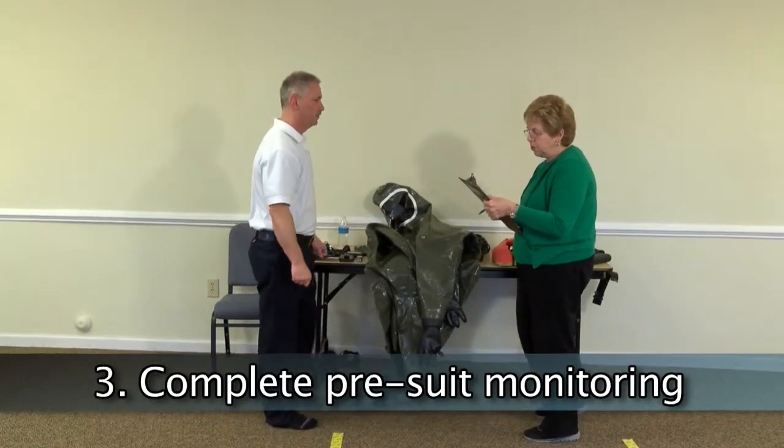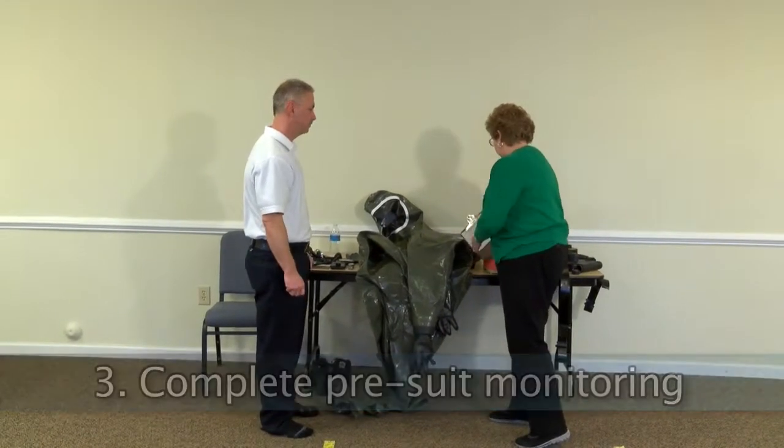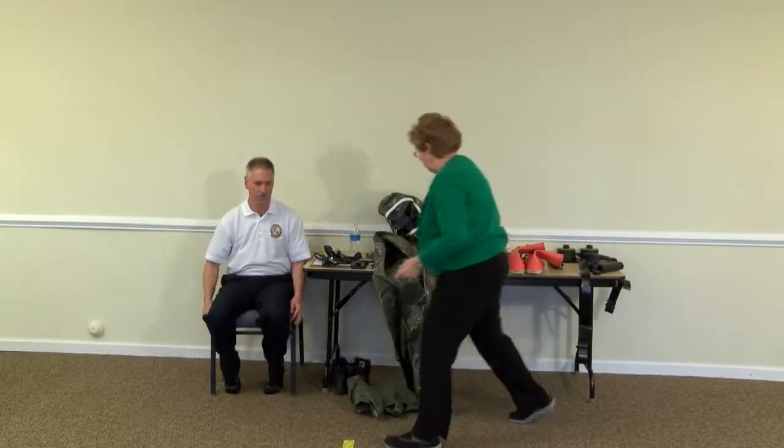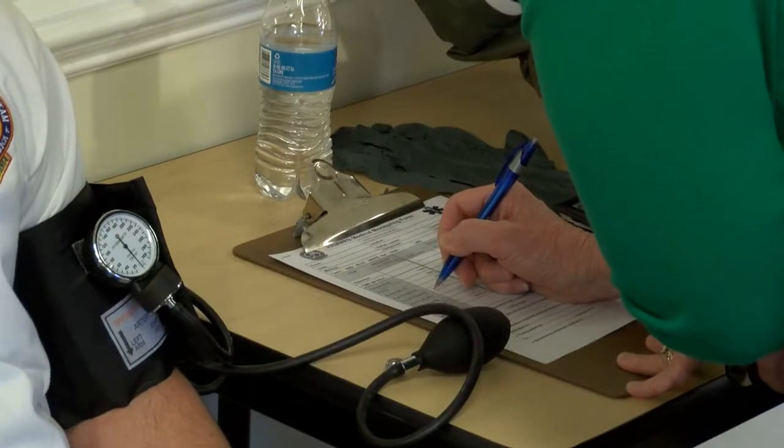Complete pre-suit monitoring by doing baseline vital signs. Prior to donning PPE it is important to screen overall health by assessing baseline vitals. This helps to ensure the readiness required for the rigor of working in PPE.